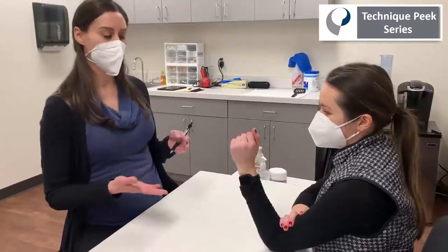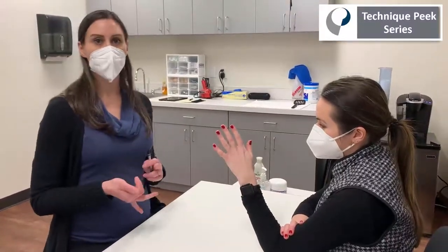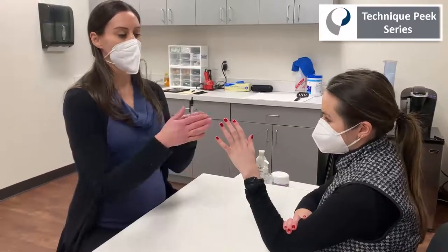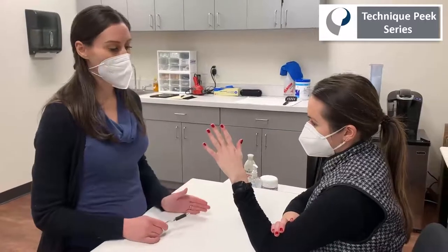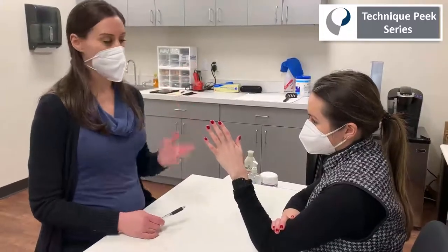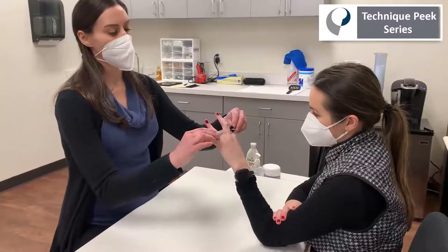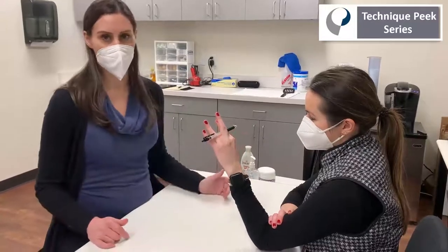We're going to pretend that it's the middle finger that's affected here. I'll show you how to work on PIP extension as well as PIP flexion — it's all a matter of how you are splinting it in relation to the adjacent digits. If you're looking to work on PIP flexion, if someone is very stiff and doesn't have that PIP flexion, you're going to position that middle finger in more hyperextension in comparison to the adjacent digits.